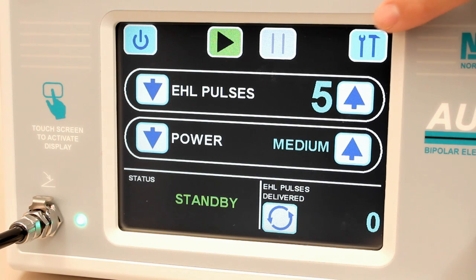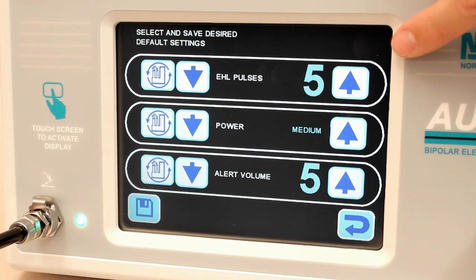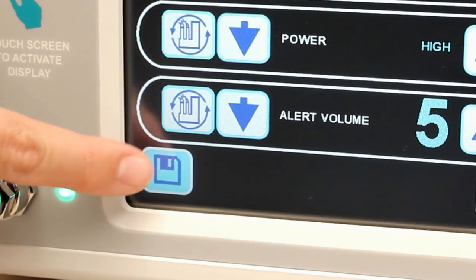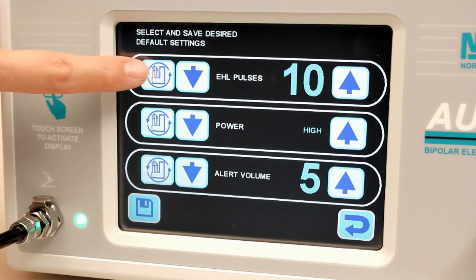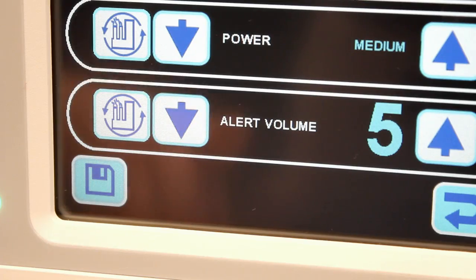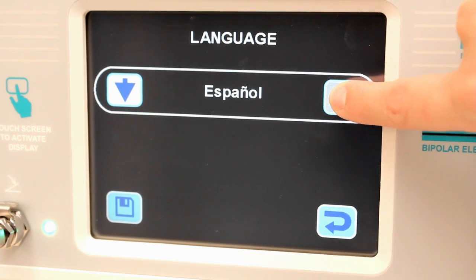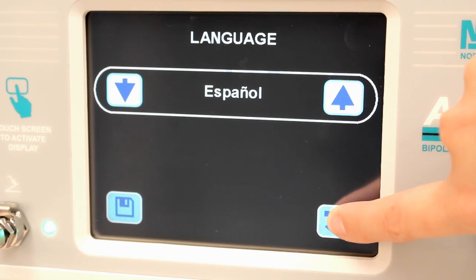Various tasks may be performed using the setup menu. Factory default settings can be changed and stored by depressing the program defaults button and then changing the number of EHL pulses or power level to the desired preferences. Whenever changes are made, be sure to press the store data icon to save the information. Restoring the factory set defaults can be made and stored at any time by depressing the restore factory default icon. Remember to always press the store data icon to save the changes. Similar modifications can be made to the alert volume and the default language for the device. Changes may be disregarded and any previous screen may be accessed by depressing the return to previous screen icon.